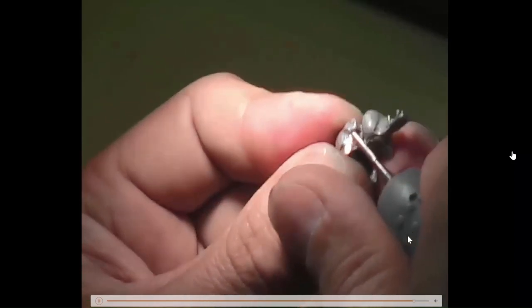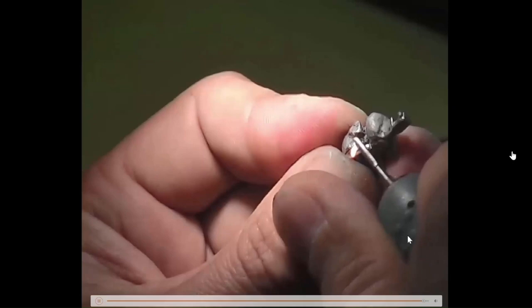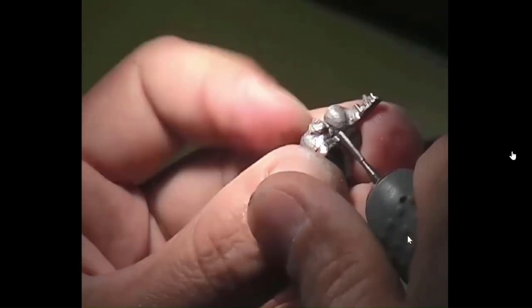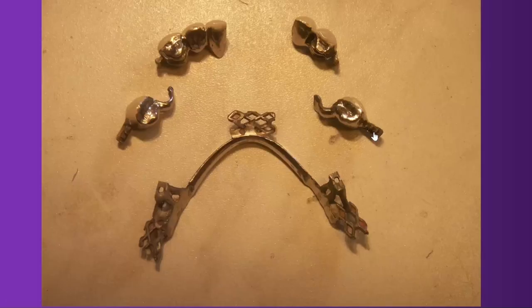So this is how we refinish the whole structure. And yes, the adaptation was really amazing. And of course, that part we would remove it completely. And here you see the conjunctor, the matrix of the conjunctor. You see all the components here again. That's what you were getting in the end.